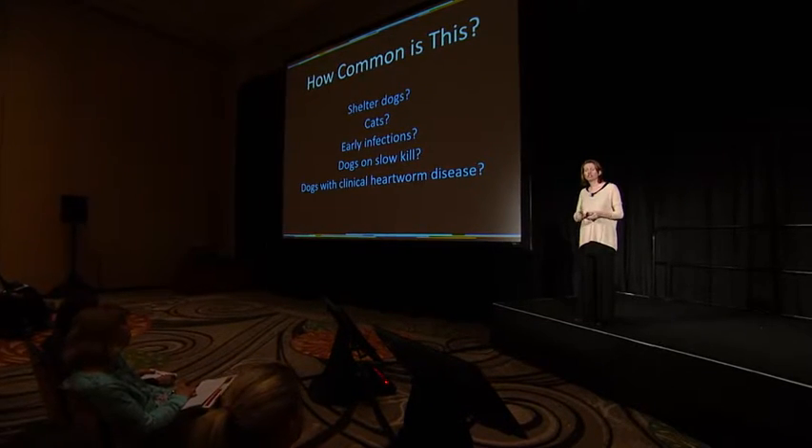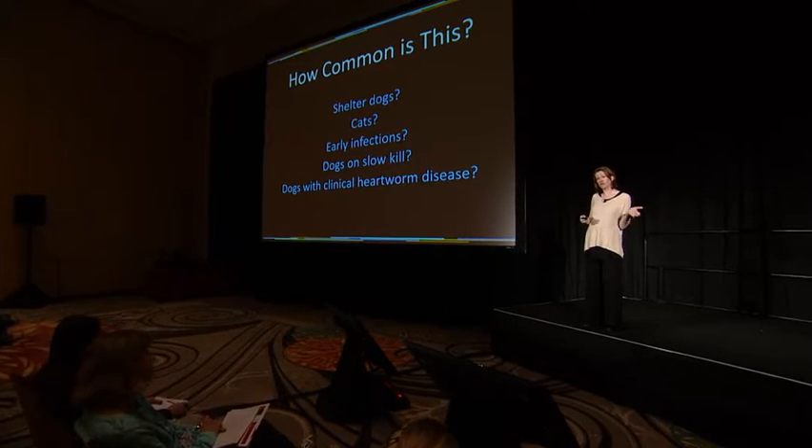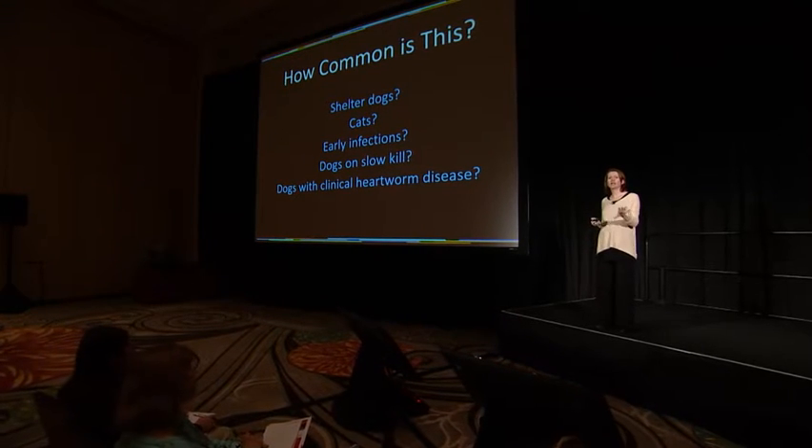What about dogs with clinical heartworm disease? We've had a number of these cases submitted to Oklahoma State. It's remarkable how astute veterinarians are — these samples are submitted because the veterinarian says this looks like heartworm, tests the dog, gets a negative, and says that can't be right. These dogs are coughing, have a murmur, are exercise intolerant, not on preventive, and live in high-prevalence southern U.S. areas. Two cases came from cardiologists who actually saw the worm on echocardiogram while the antigen test was negative. Those samples converted from negative to positive with heat treatment.